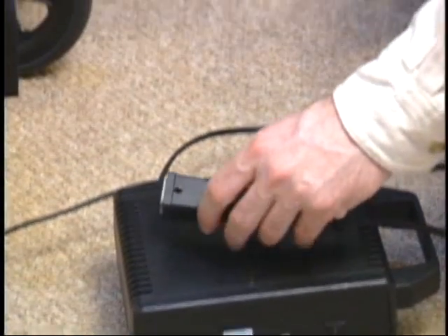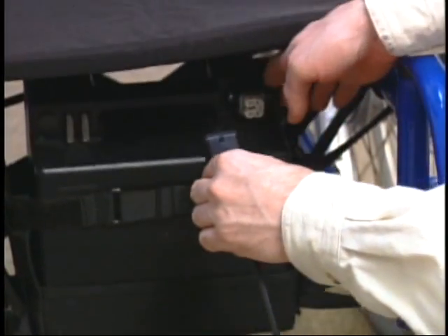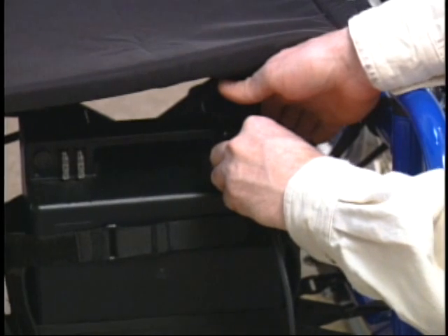The fully automatic ultra-lightweight travel charger of the E-Fix works on any current in the world. The battery does not have to be removed for the charging process.